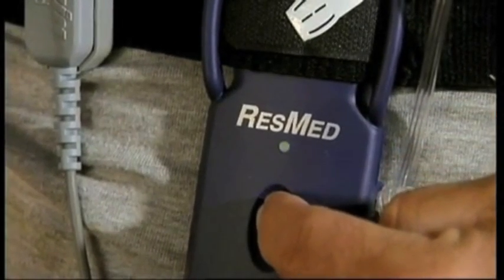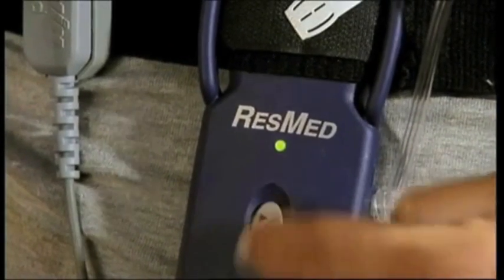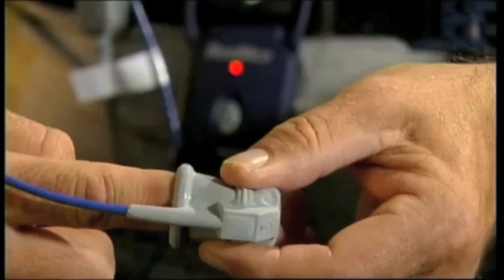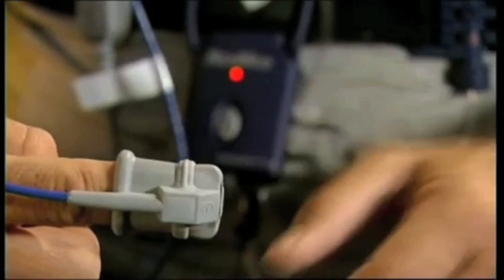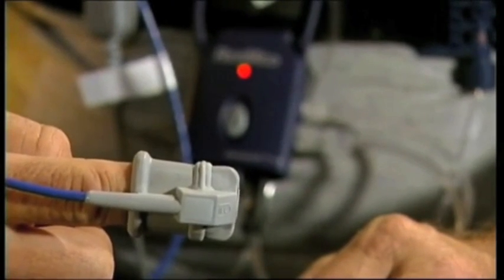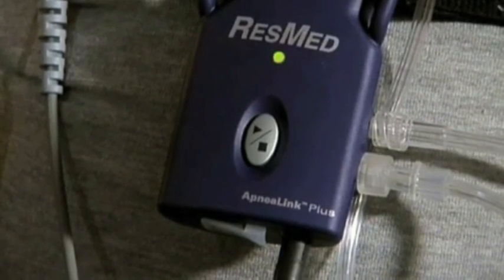Turn the ApneaLink Plus recorder on by pressing and holding the ON switch until the green light illuminates. This will dim around 10 minutes after recording begins. If the light shows red, check that the pulse oximeter and finger pulse sensor are properly connected. Once corrected, the light will show green after a few seconds.